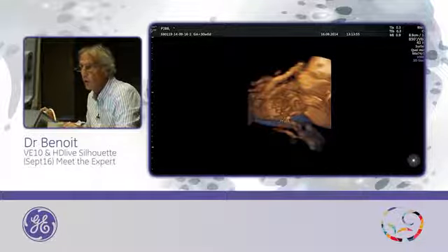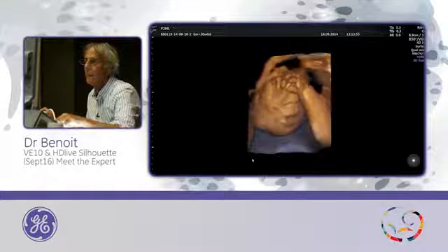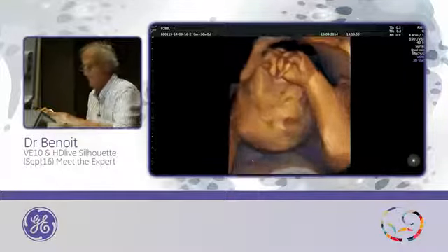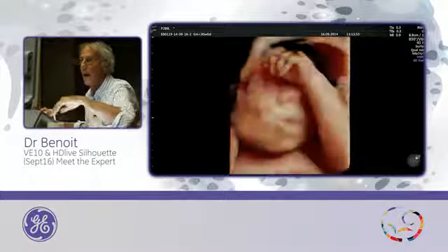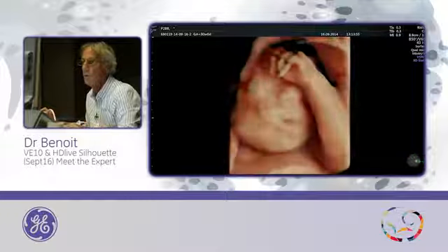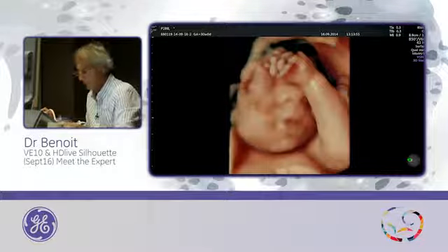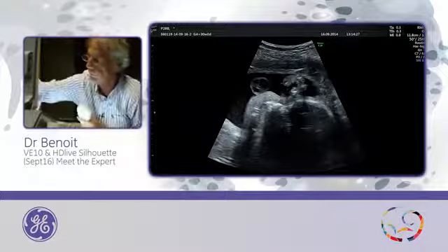Don't cut a finger. It's okay. And with HDlive, or this one, move the position of the light. And it's okay. So now I will open some cases.